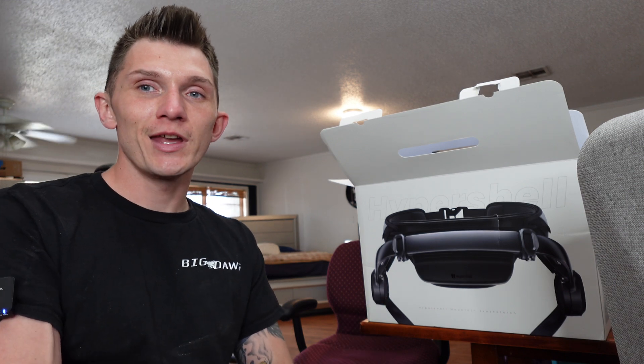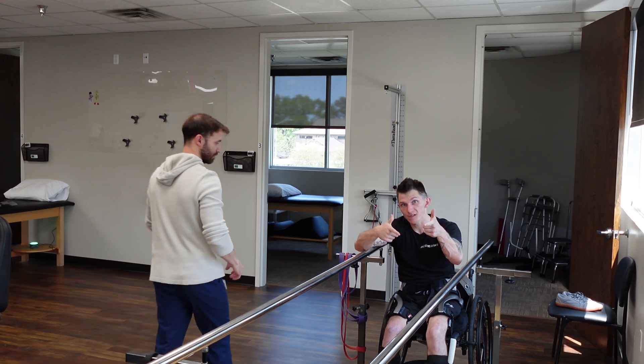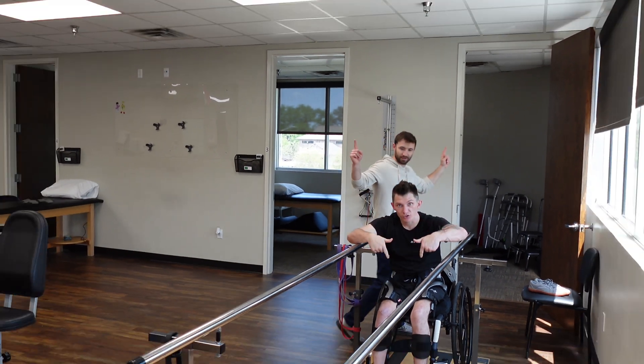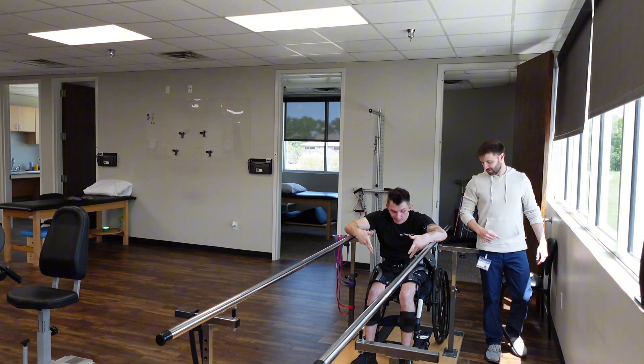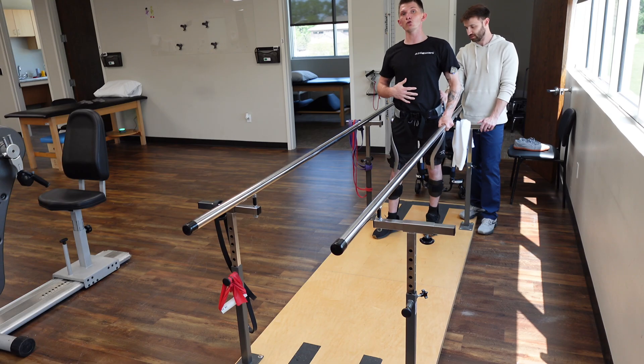Look what came in right before therapy — the HyperShell. We're at the therapy center with my boy Scott, about to try to figure out what the hell is up with these HyperShells. For me, being a paraplegic trying to recover from this spinal cord injury, I've been sitting for too long.